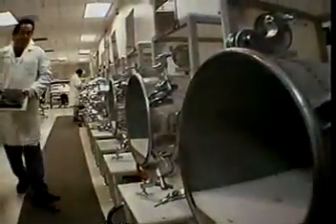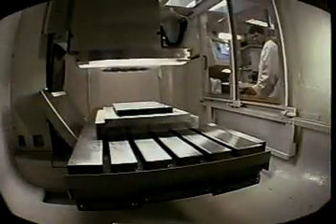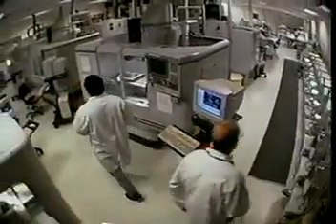After a few hours in a pressure vacuum chamber, they become blocks of hardened resin, with many plaster models inside. From here, each tray is placed into a destructive scanning machine. With 11 of these in its facility, Align Technology is the largest single user of this technology on the planet.